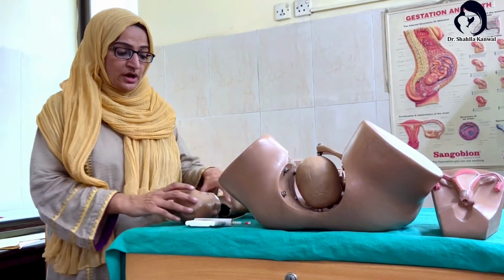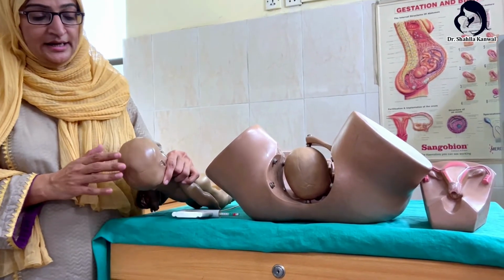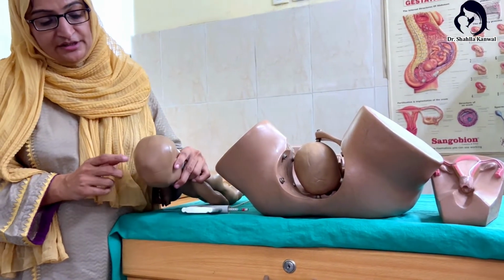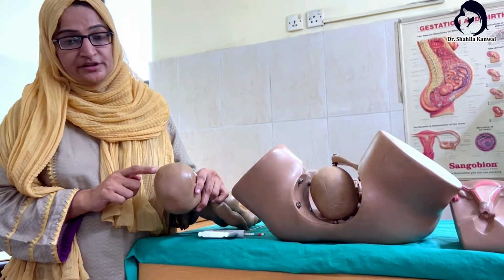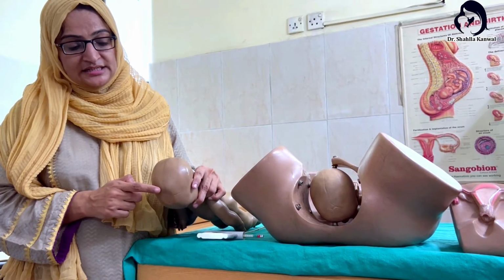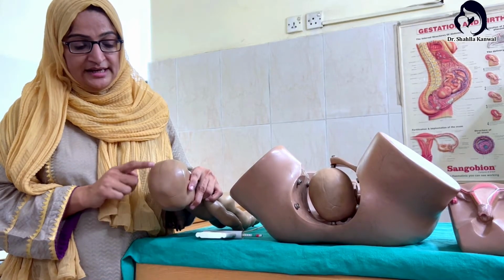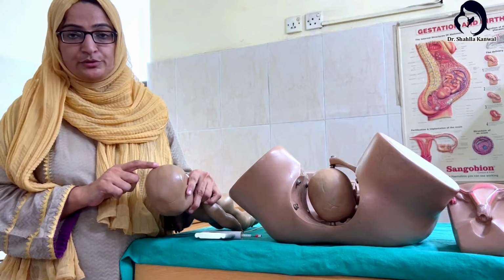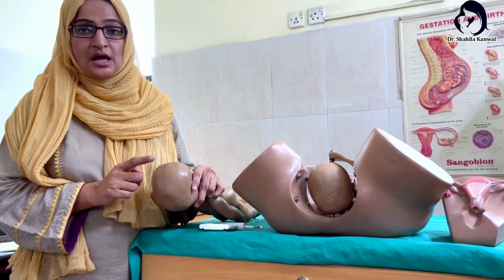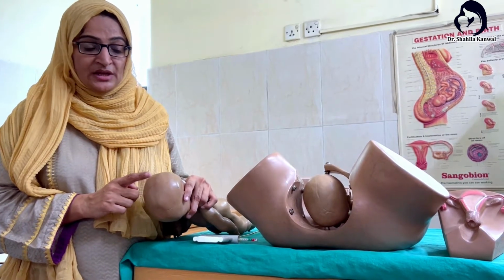First of all, what you have to identify regarding the fetal head is the flexion point. What is the flexion point? Flexion point is on the fetal head, 3 cm anterior to the posterior fontanelle and 6 cm posterior to the anterior fontanelle. This is the flexion point where we have to apply the Omni cup.